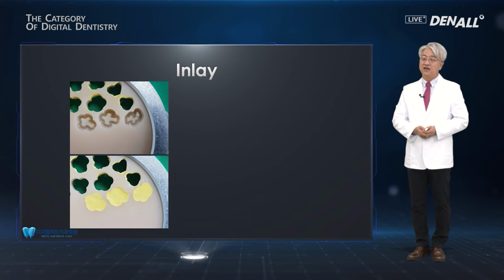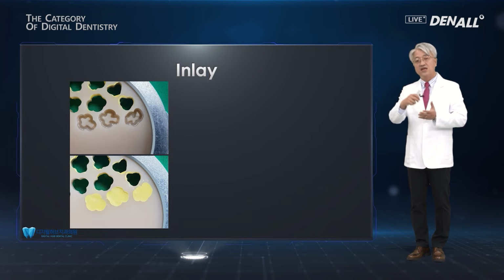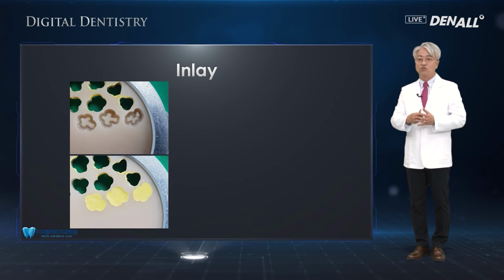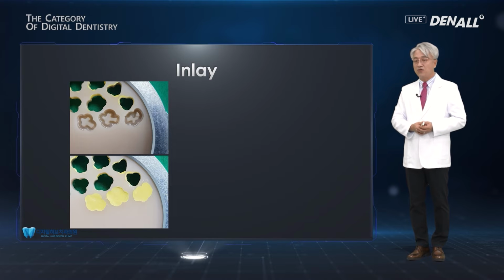So this is the submerged approach that I use. After designing the inlay and milling the inlay material, if it's a crown, then using a supporter, you can fix it in place. But an inlay is small, and with the contact and occlusal surface, if you use that type of connector, then adapting to the patient could require a lot more time, and it could actually distort the occlusion.